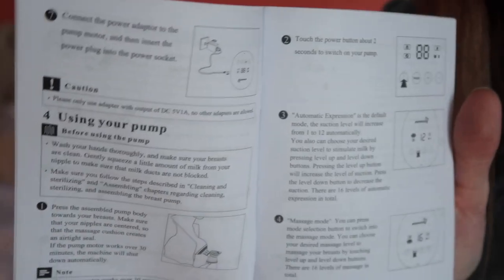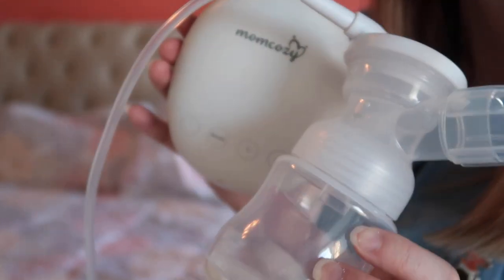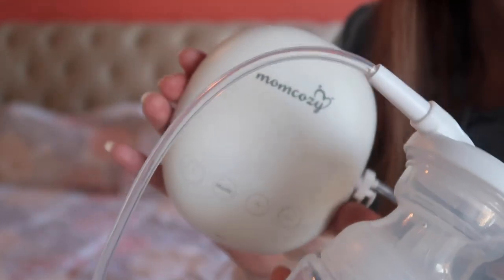It tells you exactly how to put everything together, and has more information about using the pump. I think this is awesome. It's a super affordable electric pump — I had a handheld pump I used in the car and on trips last time, and I think this would have been so nice to have. Just throw it in your bag really quickly.